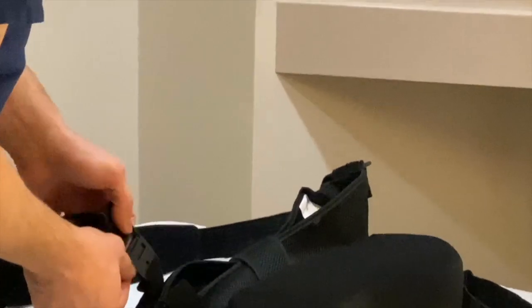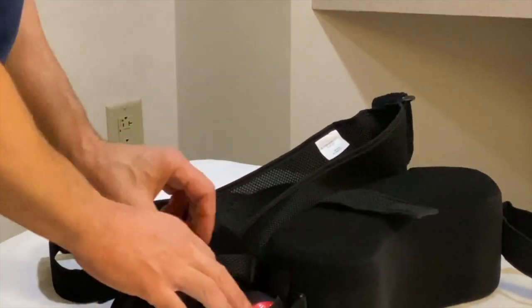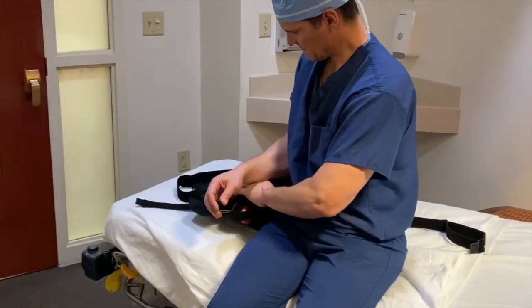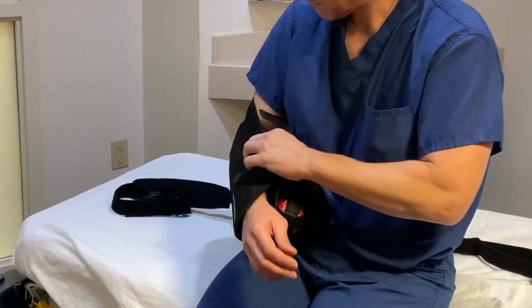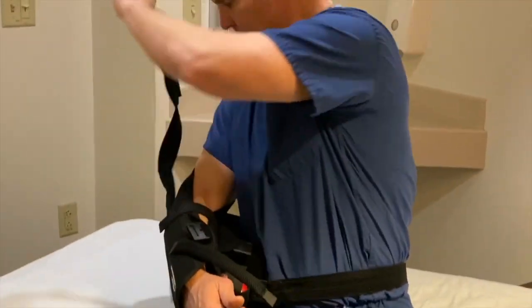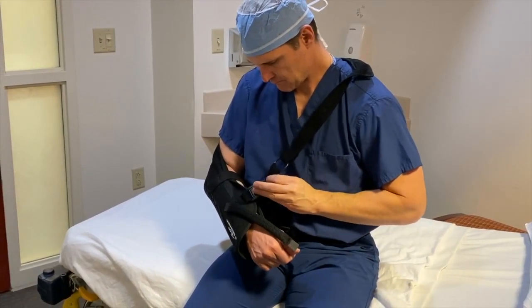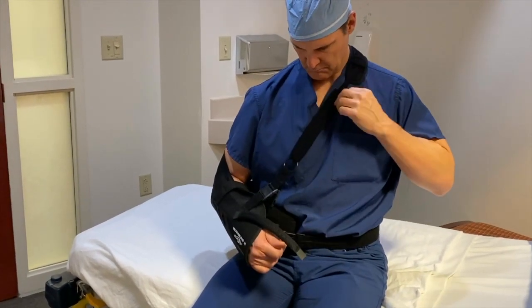Putting the sling on is essentially the same as taking it off, just in reverse. Make sure all the attachments have been loosened up — I've unclicked the clips at the front, undone the thumb strap and the forearm strap, and put the waist strap behind me. That way you can just set the sling underneath your arm without moving your shoulder much. Then attach the forearm strap so it keeps your elbow back. Reach behind you to grab the waist strap and click it on the front, then bring the strap over around your neck and attach it to the clips on the front by your wrist. You can adjust the strap around your neck so that the pad is closer to your neck and doesn't hurt, and then finally the thumb is attached.